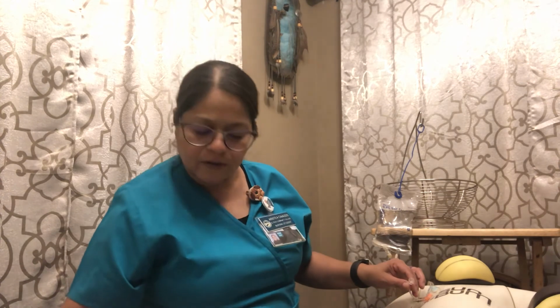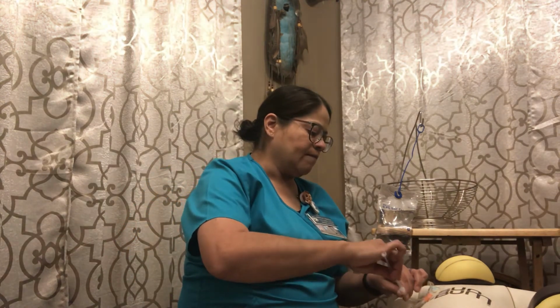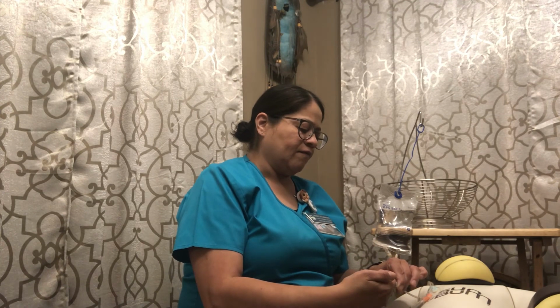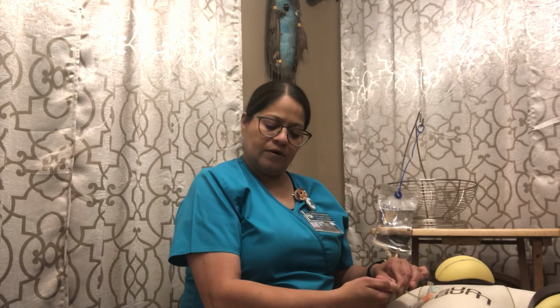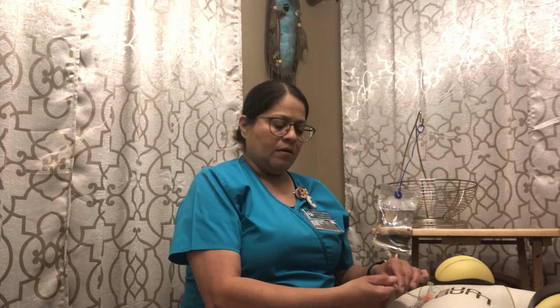Get my medication, which is my 3rd and final check. Well, my last check here at the bedside. Make sure it's primed to the top. Connect my medication. And I'm going to inject 0.5 slowly. And then I'm going to wait a minute. And then I'm going to inject 0.5 mLs slowly. So this is done slowly, and that's done.